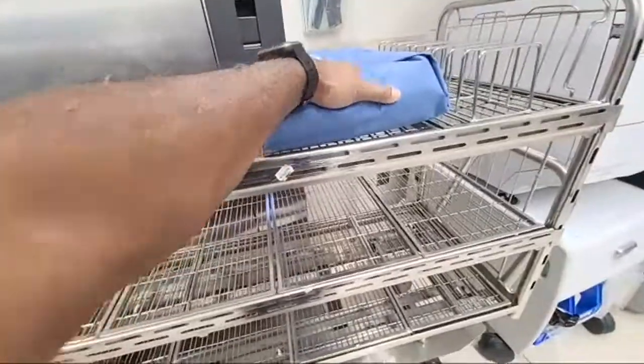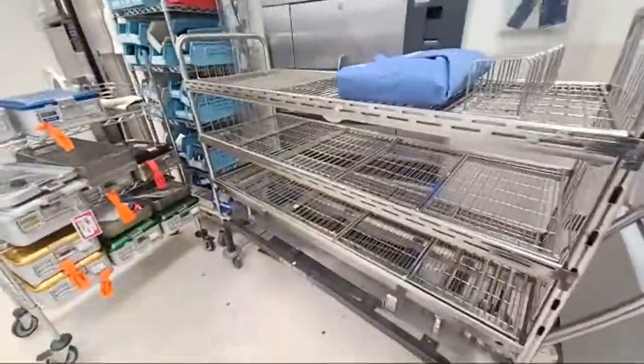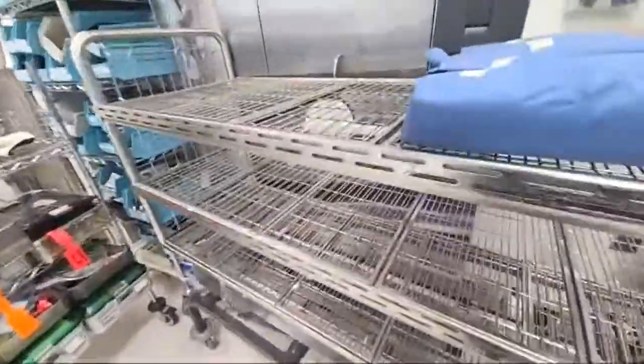And of course, we want to put heavier items, the rigid containers, on the bottom, building up to the wrapped items, for reasons of the heat, the conduction, the things that are going to sweat or condense. The condensation is going to form. If it happens, we want to protect our wrapped packs.